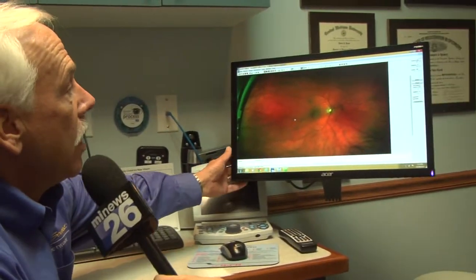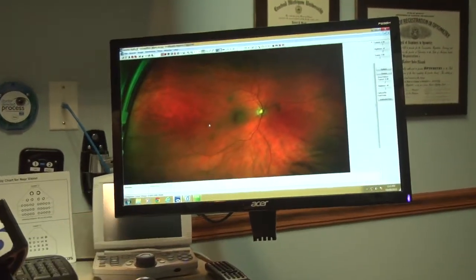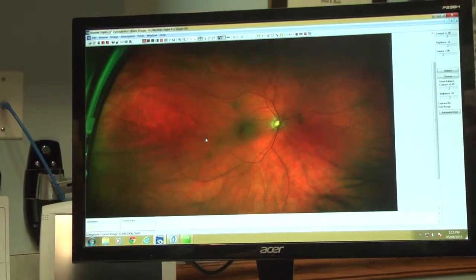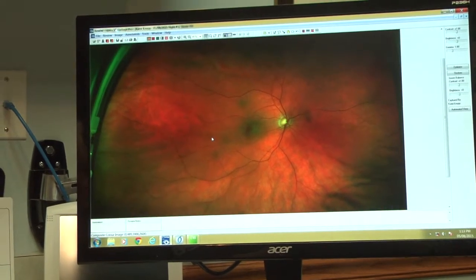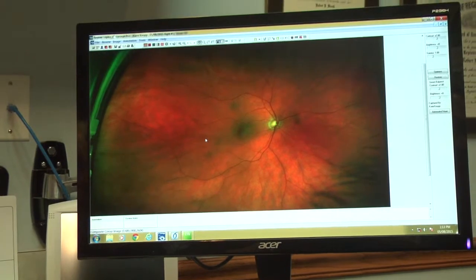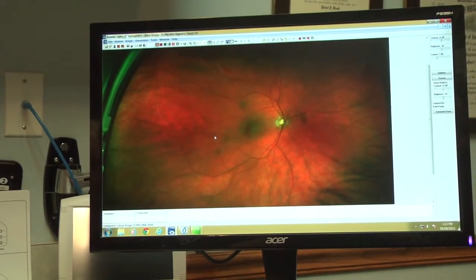Okay, now can you give our viewers some idea of what we're looking at here? Yes, absolutely. This is a standard image that we've produced here of the inside of our eye. So we're like standing out in front of someone looking through the little opening of the eye, looking through the pupil, and we're going all the way to the very, very back of our eye. So this is the retina here essentially that we're looking at, and this is, in a sense, the lining of the inside of our eye.